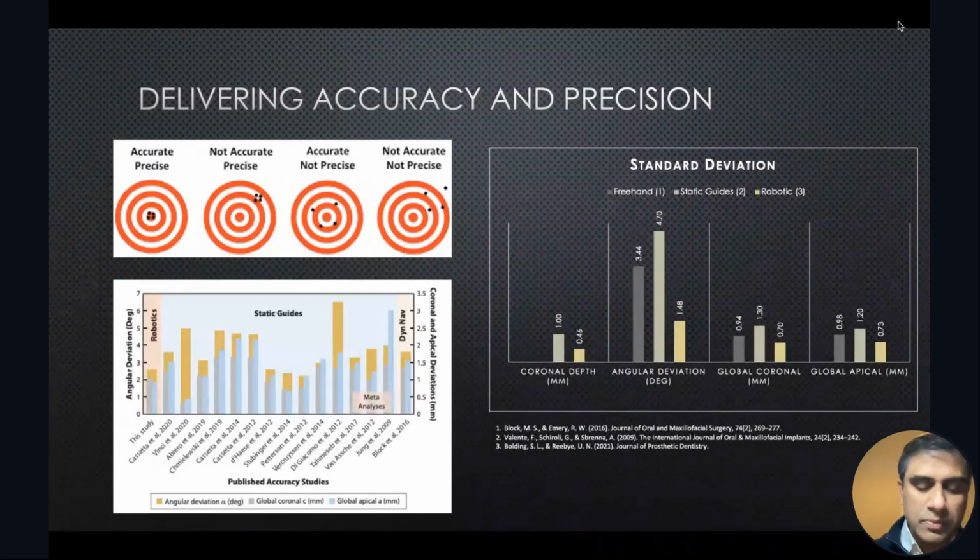And that's important. As we know, we don't want to compromise or sacrifice the necessary bony prominence or the actual location, how you place palatally or labially or lingually, or it depends on those things. So those things are accurate information, and the accuracy just gets better and better with dynamic navigation systems.